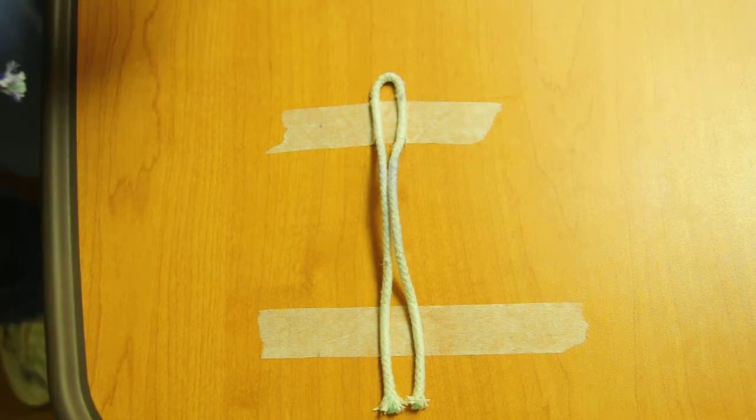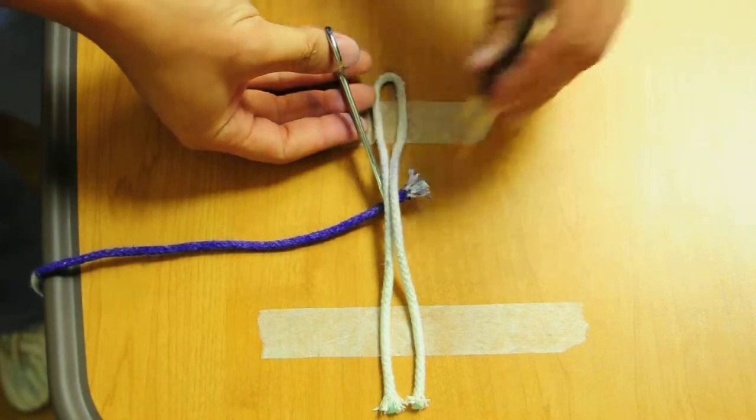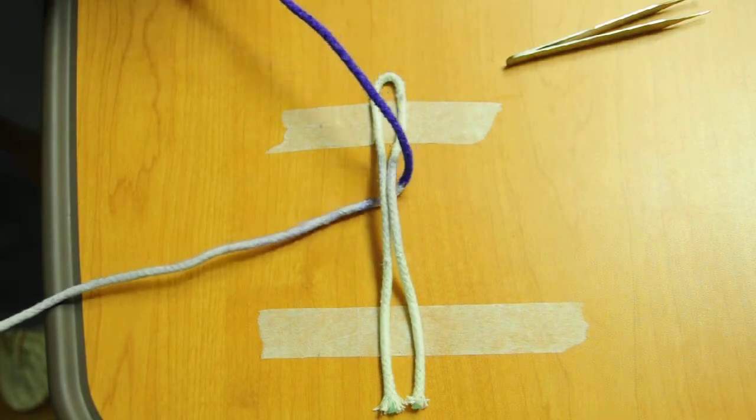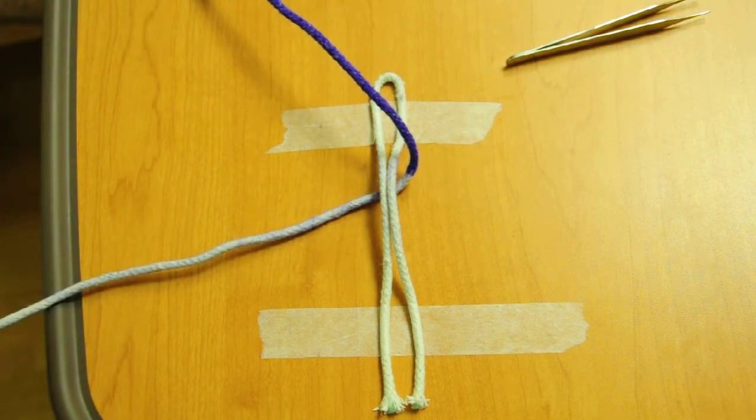If you're on the right side, say the attending comes here, makes a suture, comes here. Say they're doing something, you have to tie one-handed ties.